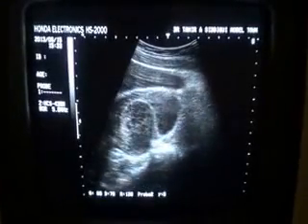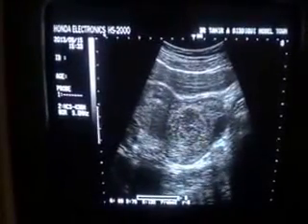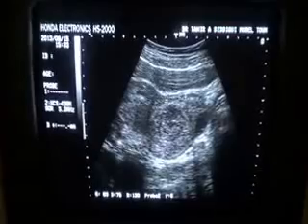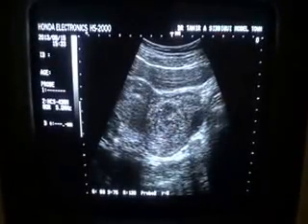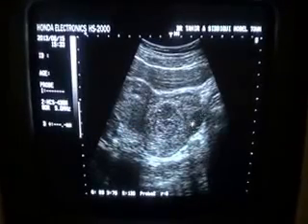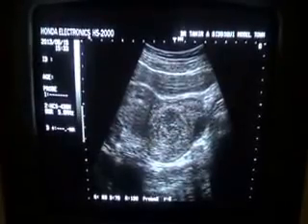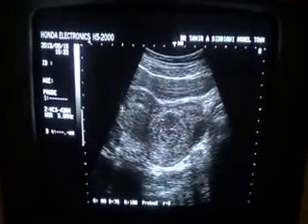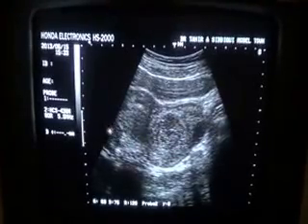Now let's focus on this area. This is the tube. This is the left fallopian tube, and this is a cystic area full of internal echoes, thick internal echoes with a small amount of fluid within it, and no calcification is seen in it, no solid element is seen. This is the uterus, this is the endometrial canal in transverse section, this is again the ovary.